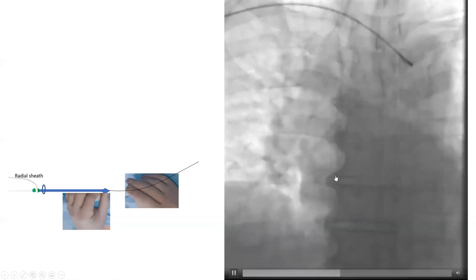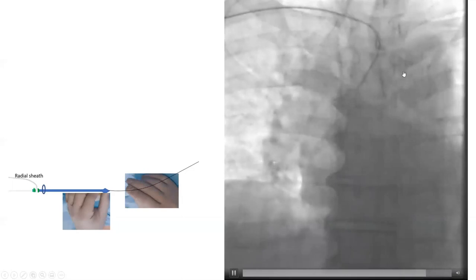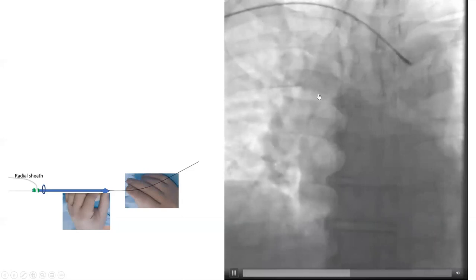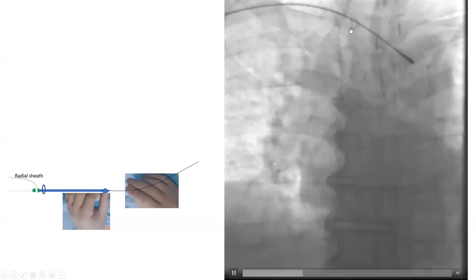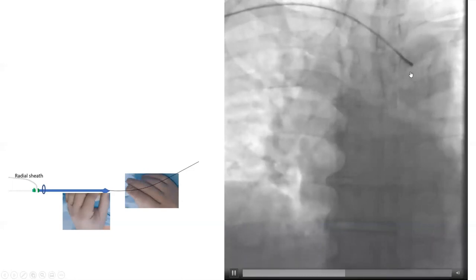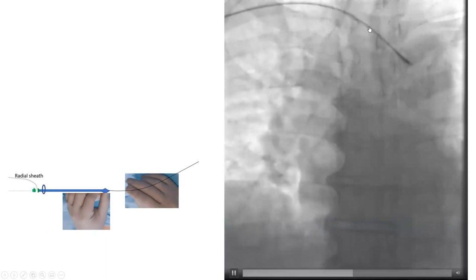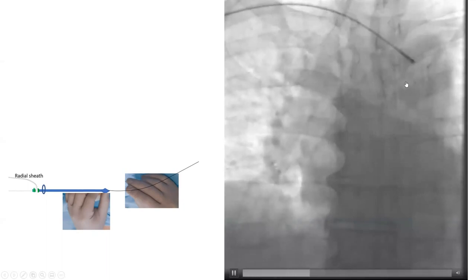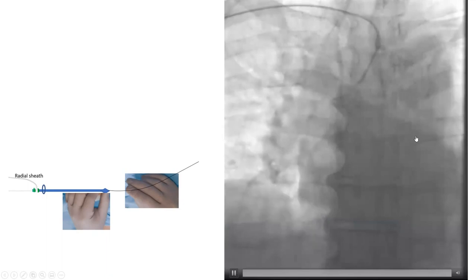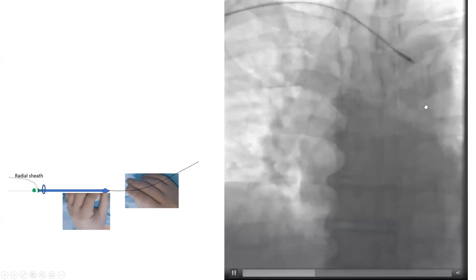There are a couple of pitfalls. One is that people think doing a deep breath will help — that's not the most helpful maneuver. The single most helpful maneuver is to just pull from the descending with a counter-clock. A second pitfall is that people do counter-clocking while the catheter is still up in the innominate. A key technique is to get the catheter all the way down in the descending and pull from descending to the arch with a counter-clock, and from the arch fall into the ascending. If you try those maneuvers from the innominate, you're going to fail. You have to advance your catheter into the descending aorta and pull back. Don't pull the catheter too much — start your maneuvering from the descending. That's the key idea.